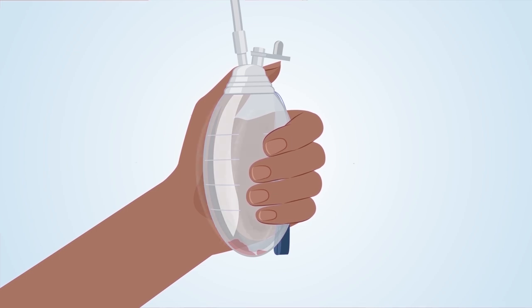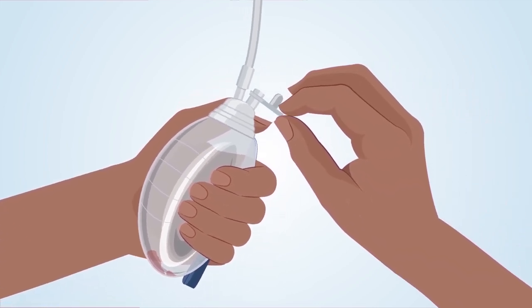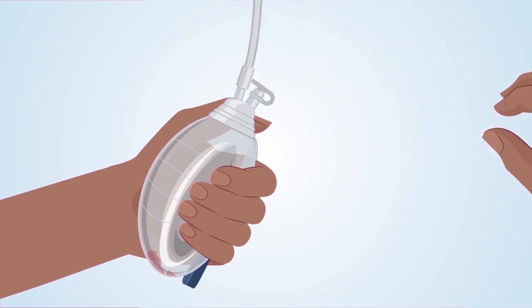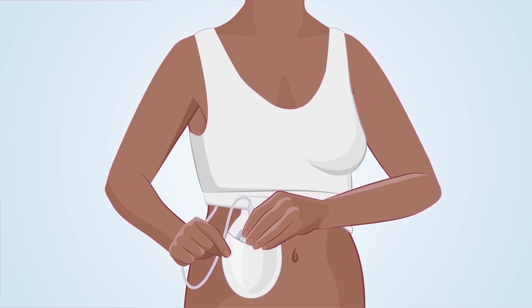Step 4: Squeeze the sides of the bulb together until your fingers feel the palm of your hand. Squeezing the bulb will restart the suction. Step 5: Continue to squeeze the bulb while you put the stopper back in the plug. Check to see that the bulb stays fully compressed to ensure that there is suction. Step 6: Place the bulb back in the pouch of your surgical bra or camisole, or clip it to your clothing.